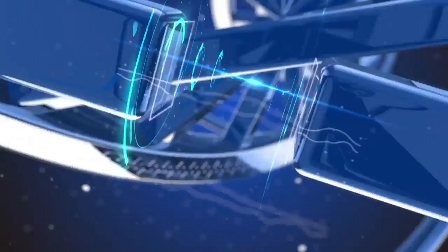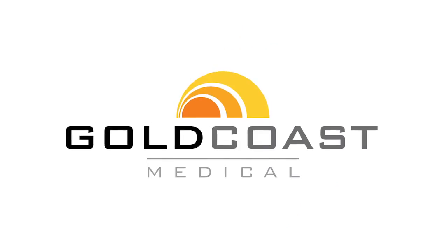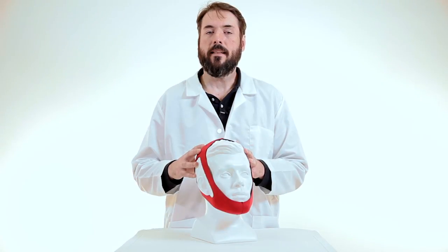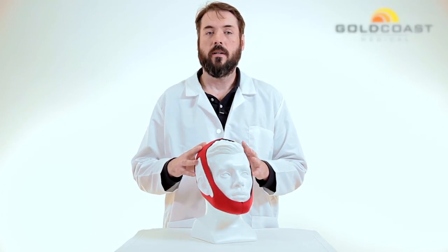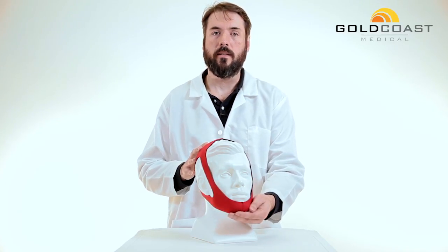Hello everyone, Charlie here, your medical supply specialist with another FYI product video. Today we're looking at the CPAP chin strap. This will improve CPAP therapy by helping to keep the mouth closed during sleep.